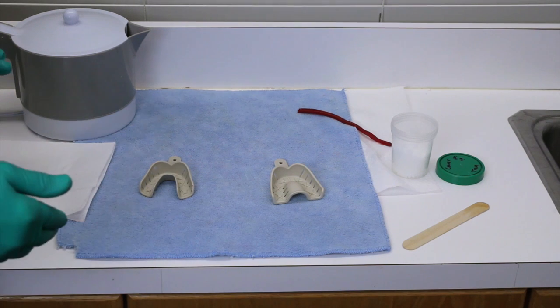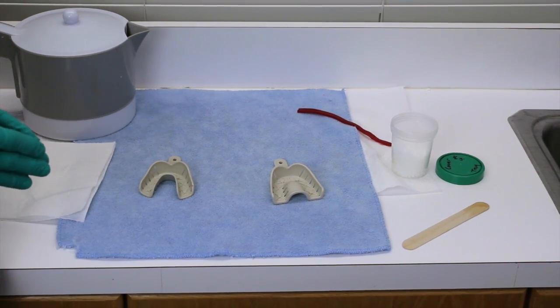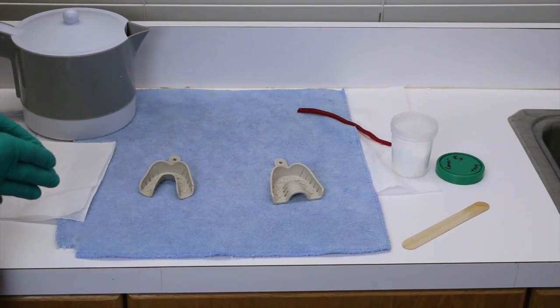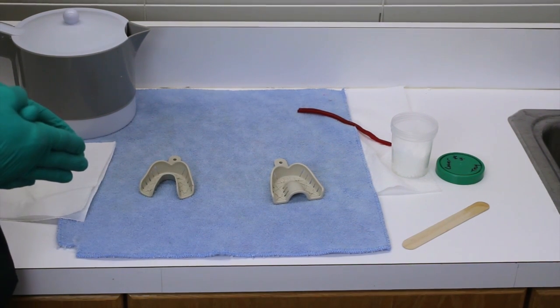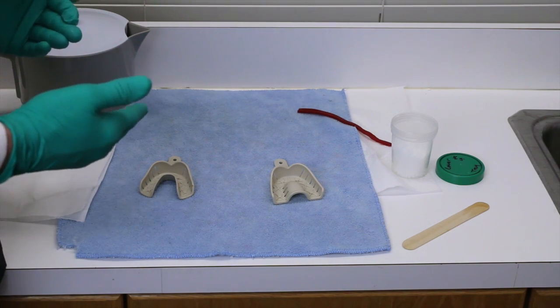Now, if we form the trays we described, modify the trays as we described earlier, and also if we use the recommended viscosities of alginate, which we'll be demonstrating shortly, what I'm going to demonstrate now is really not very often necessary, and that's called custom border molding. And we have two types of materials we can use. One is a soft and one is a rigid type of border molding.